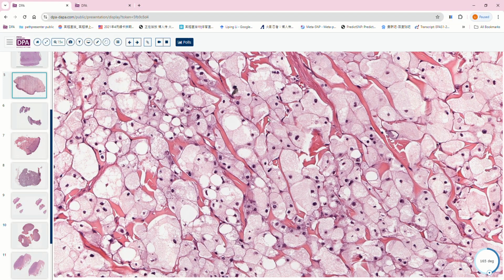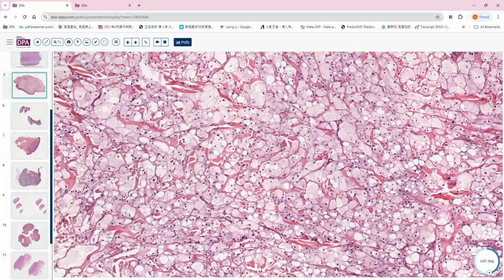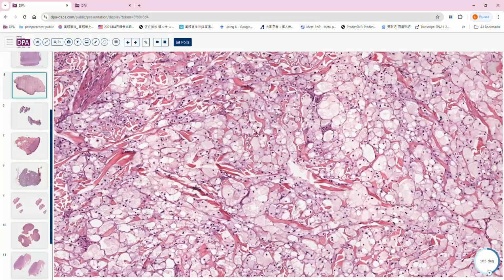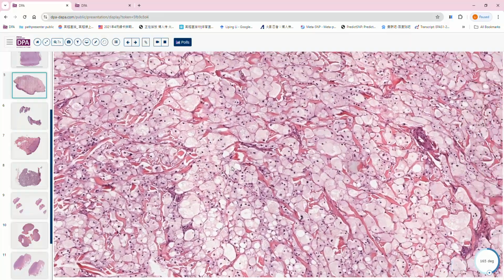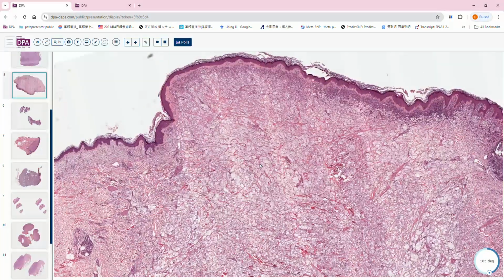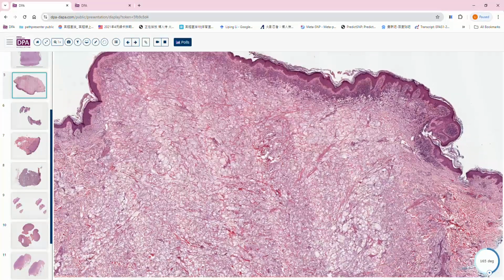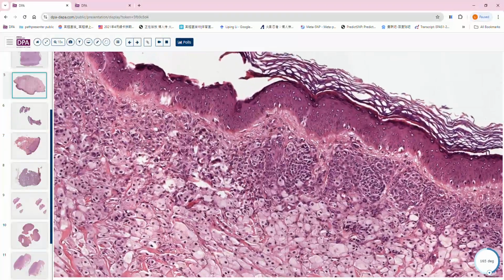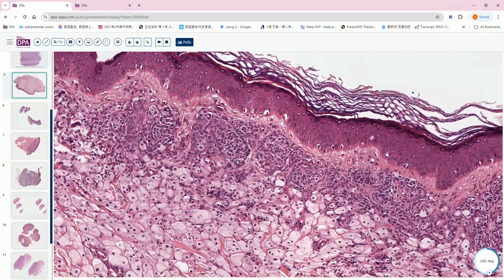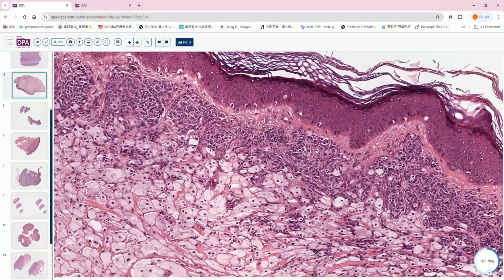There's no pleomorphism at all, but lots of cytoplasm. I was trying to find the balloon cell melanoma, clear cell variant. I think I'm going to go with this one because of the junction. I think I saw similar cells on the junction, maybe those were melanocytes that are differentiating to balloon cells, but I might be wrong. I'm not sure.